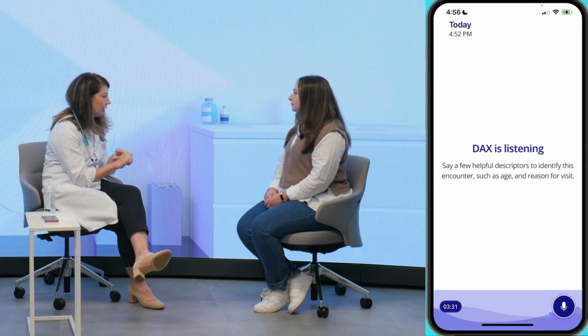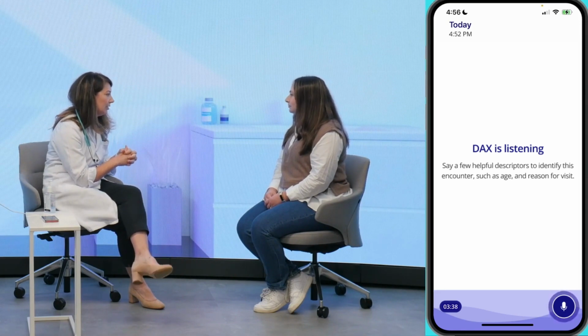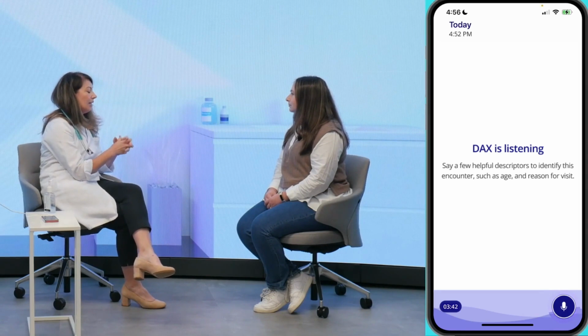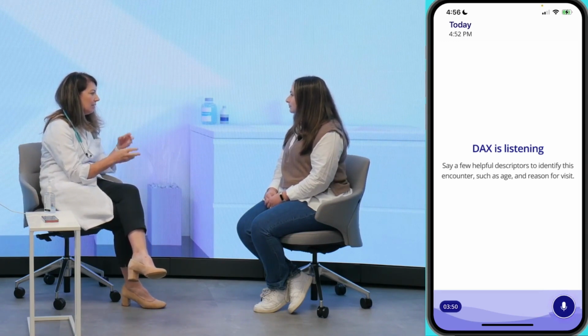I want to go ahead and prescribe an albuterol inhaler. It's 1 to 2 puffs every 4 to 6 hours as needed for any type of shortness of breath or excessive coughing you have. And then I also want to give you something to make it easier to cough up that phlegm. So we'll go ahead and prescribe some guaifenesin, 600 milligrams twice a day to help with any of that mucus, okay? Any questions about any of that?